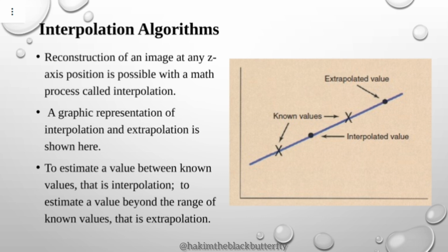I need to tell you this, that CT is a mathematical equipment. Everything associated with this equipment is mathematics.